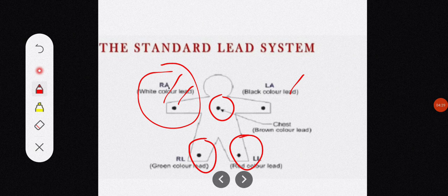So we have different leads depending upon the electrode pairs or combinations and their connection to the amplifier, and each combination will give you an ECG waveform. Some recordings will be faded, some recordings will be more clear. In total, we will record from all the lead combinations, and we will use them for representing the electrocardiogram.